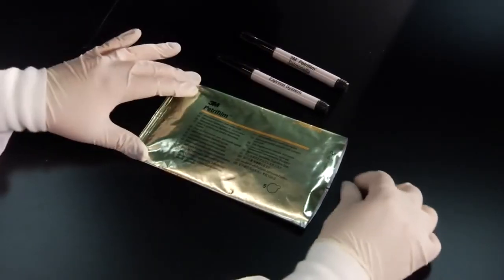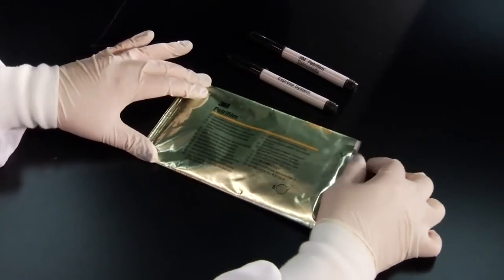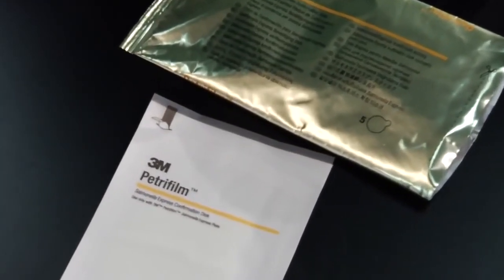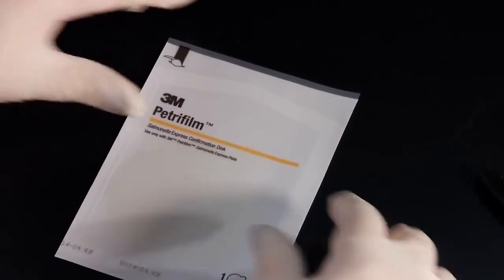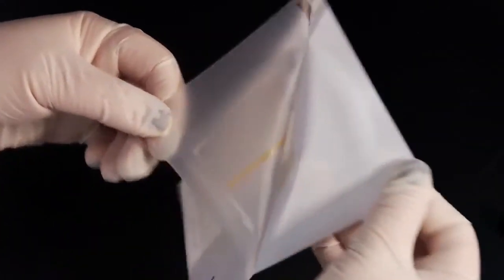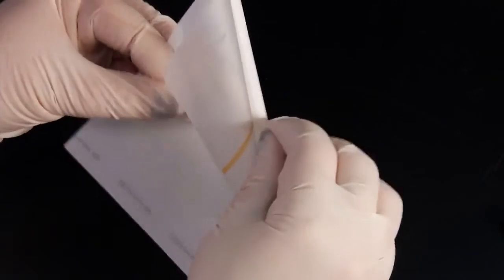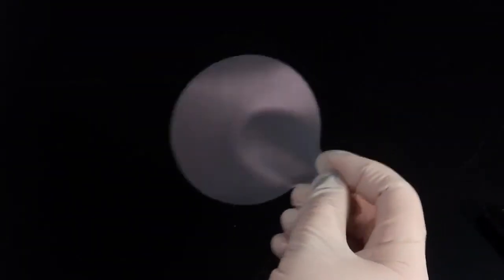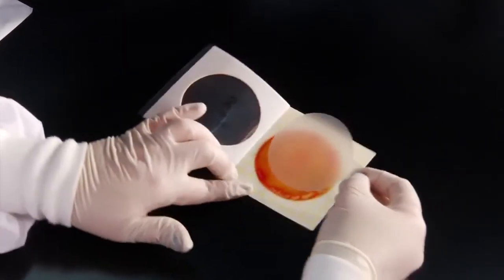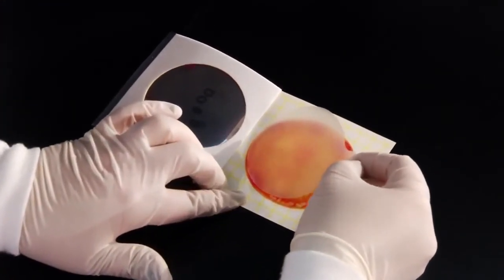To begin biochemical confirmation, remove an individually packaged 3M Petrifilm Salmonella Express Confirmation Disc from its pouch and allow it to come to room temperature. Peel the package to expose the disc's tab. Grasp the tab and remove the disc. Insert the disc by rolling it onto the gel so that you avoid trapping air bubbles. Then close the plate.